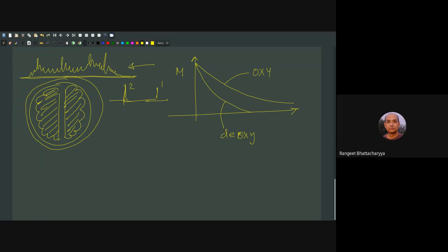It's quite simple actually. I'm giving you a simplified form of what actually takes place. You apply this sequence first. A 90-degree pulse, after that the signal goes down. Then you have the 180-degree pulse. This 180-degree pulse, remember the spin echo sequence, helps refocusing everything, which means the magnetization is coming back here and then it will decay again. This is what is happening. So we record the spectrum here.